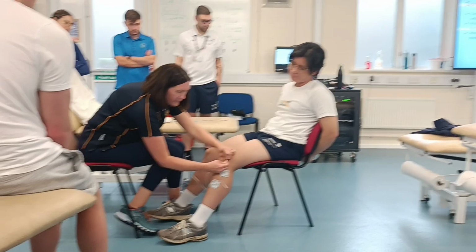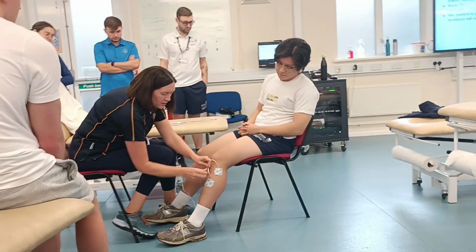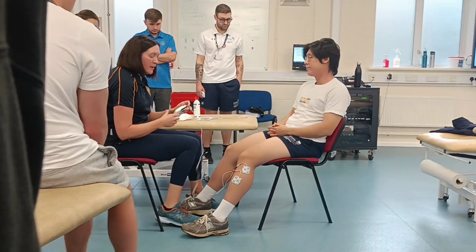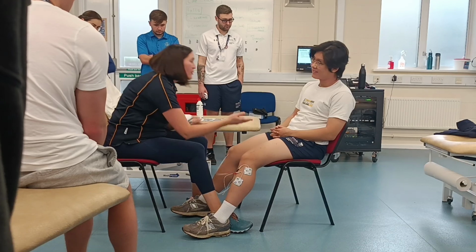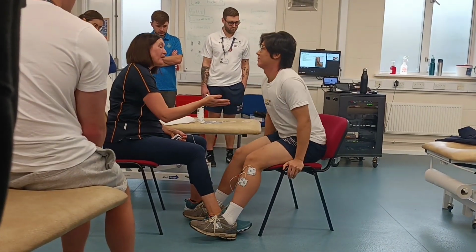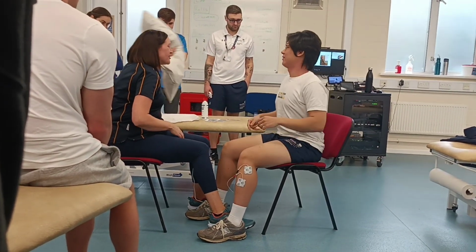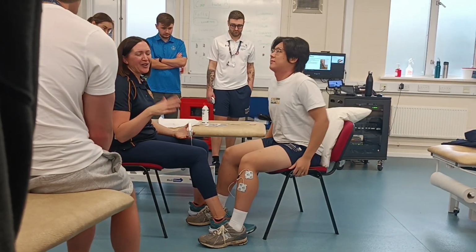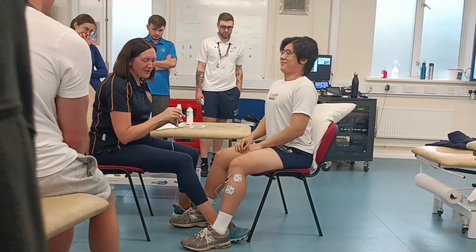Just a bit stiff. That one's going below. Okay, and then I'm all set up and ready. I'm good. I also need, can you sit up straight? Yeah. Okay. You can sit back, but it's not the greatest chair. Do you want a pillow behind you? If you're too slumped, it just alters how the nerve comes out of the spinal cord or the spinal canal, and can make it harder to stimulate.